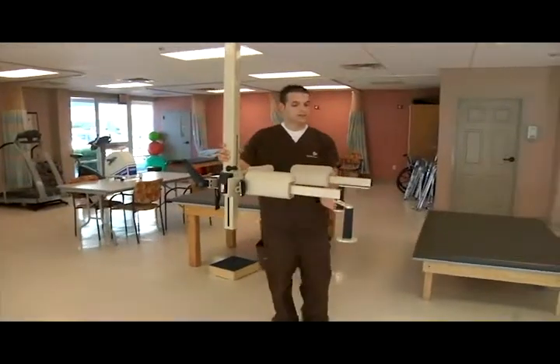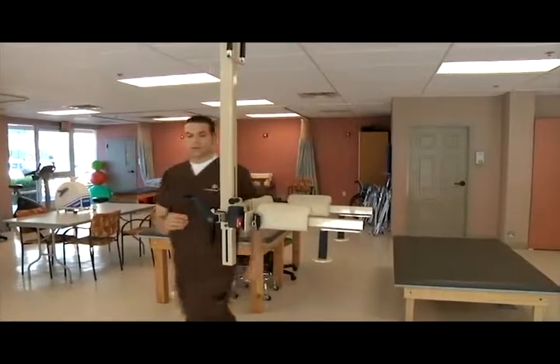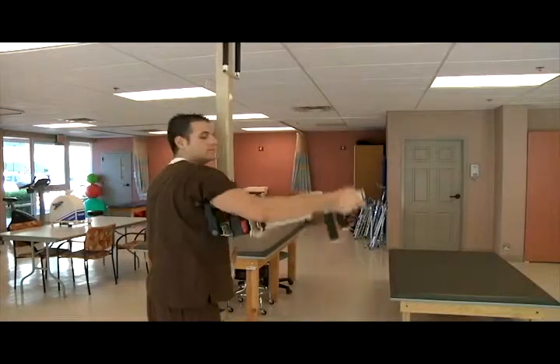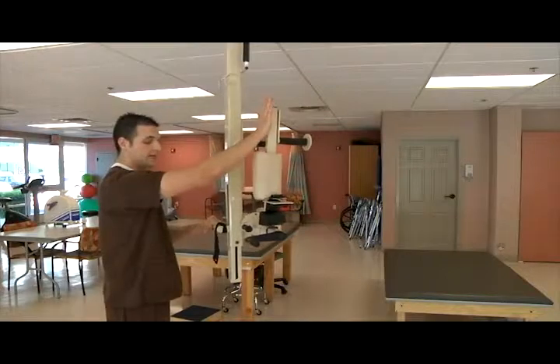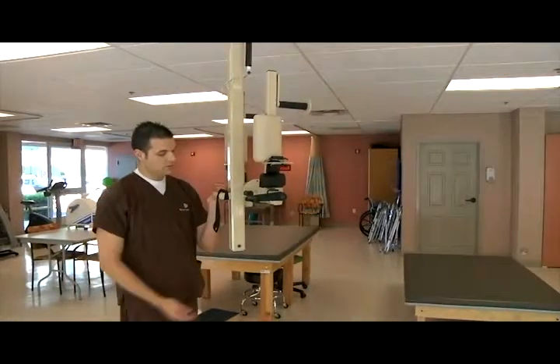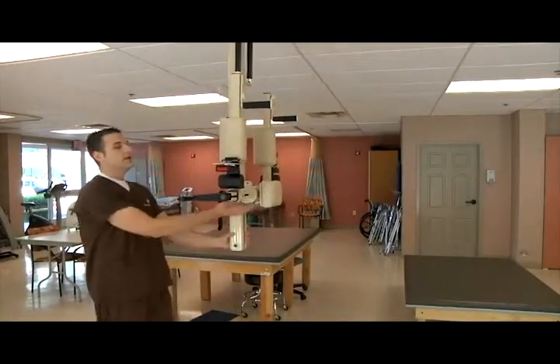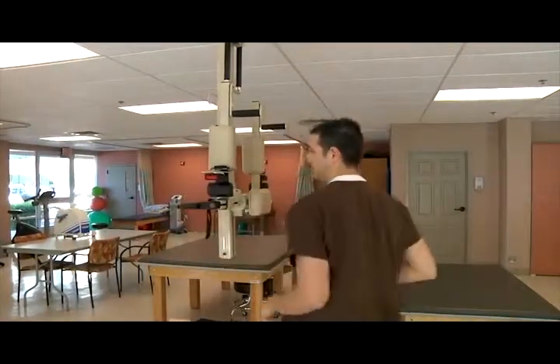So we're going to place everything right back in reverse, just like so. Okay. And then we'll pull this up, click it back in, making sure it's locked. Then we're going to come to the plunger again, pull it back into the case here. You want this column completely in there so it stays properly. And then we're going to come to the front of the device. We'll also make it tidy.